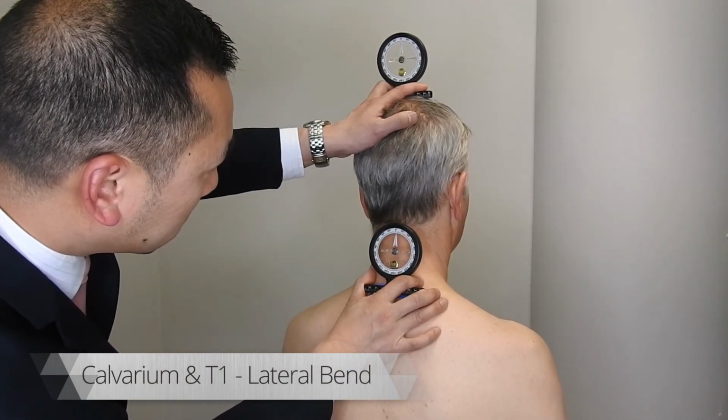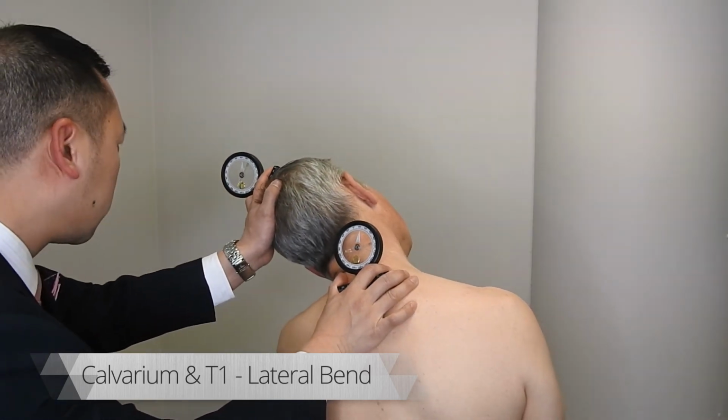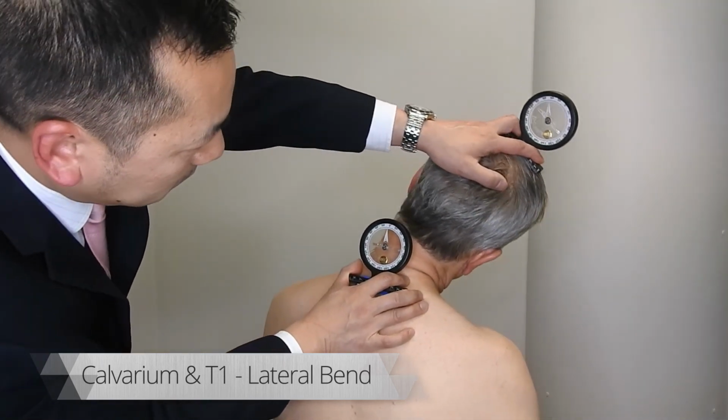Cervical spine lateral bend. Ensure the head does not rotate. And again, repeat the measurements at least 3 times each.